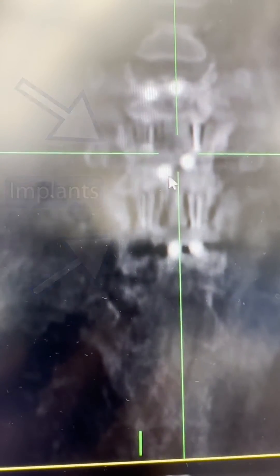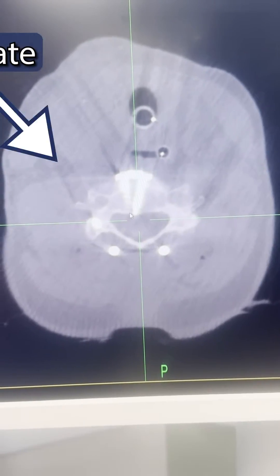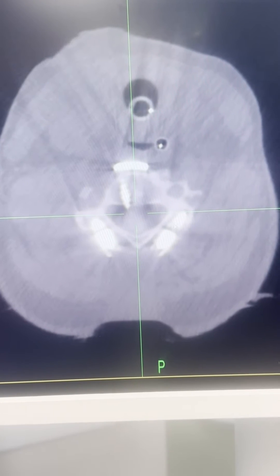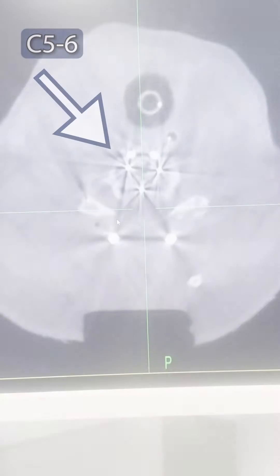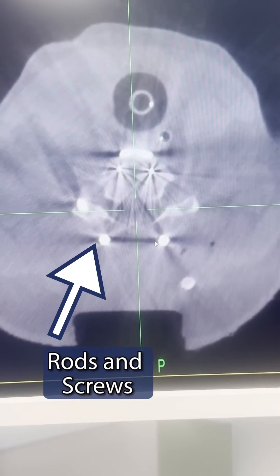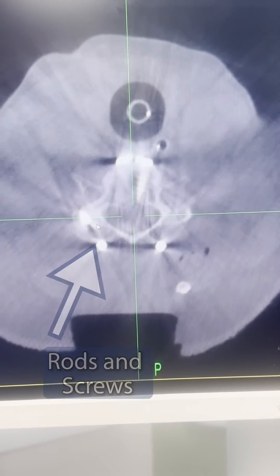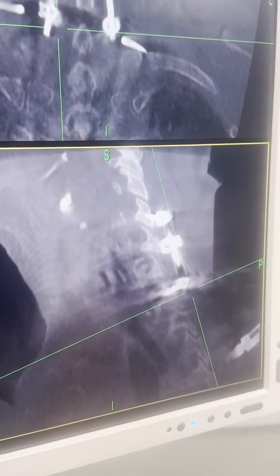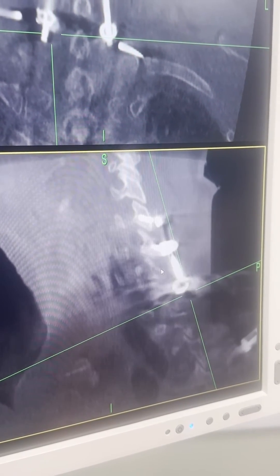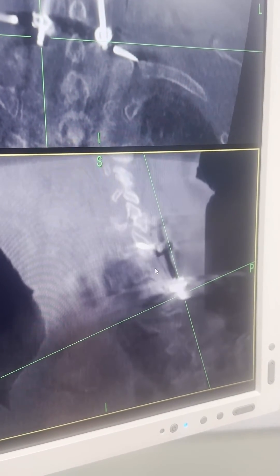Implant here, implant here. You can see our plate up front, and these are our facet screws coming in. We're coming through the five-six disc. You can see this is the rod right here. Now we're coming to the screws in six. If there's one area that will leave the screws out — see, these screw heads would just bang into each other and make it very difficult to finish a construct.